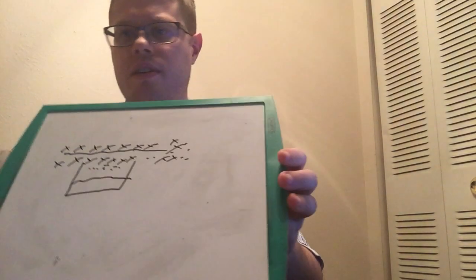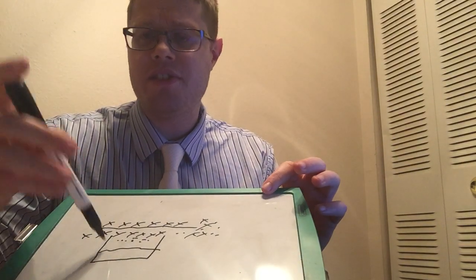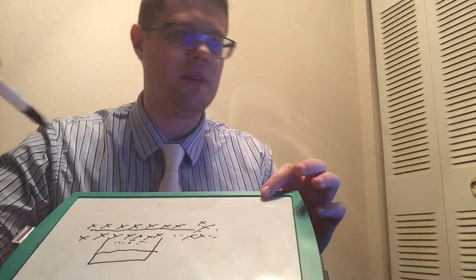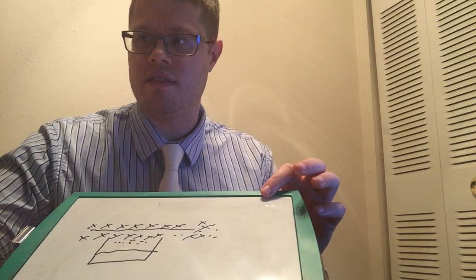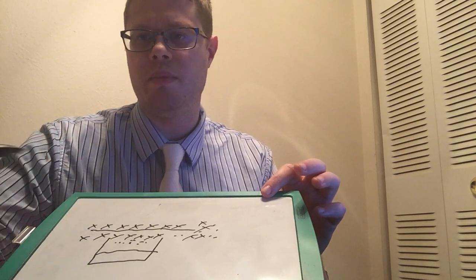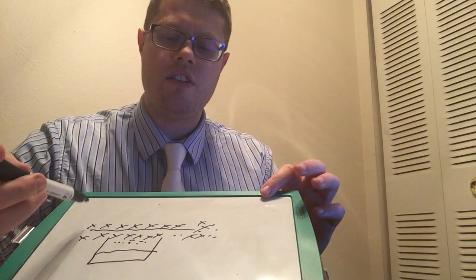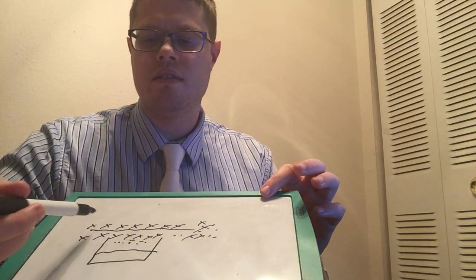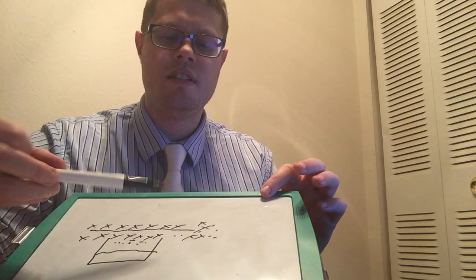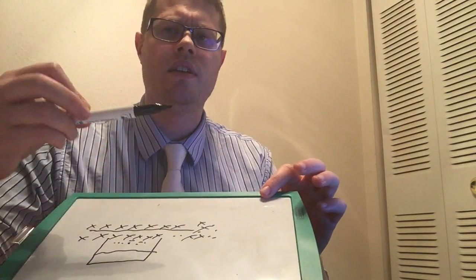So in this picture-perfect drawing, I don't know how you won't be able to understand it after seeing this. Vapor pressure is the dots, so that's the volatile anesthetic, and the X is the flow over gas. The variable bypass is located around here, where we're splitting the ratio, and depending on how much you want to deliver is how much is split. Your fresh gas flow comes up here and some is diverted down into here. The X's pick up the dots, they come out here and then they join up together for the concentration that you want to deliver to put your patient to sleep.